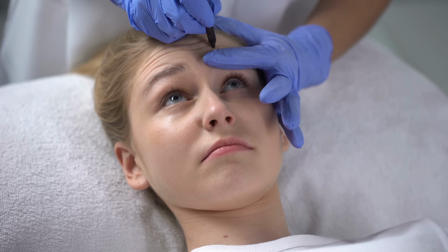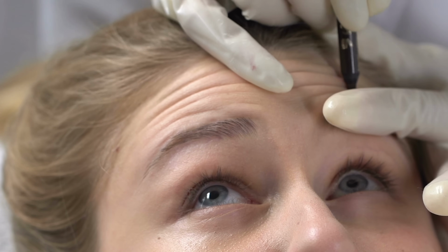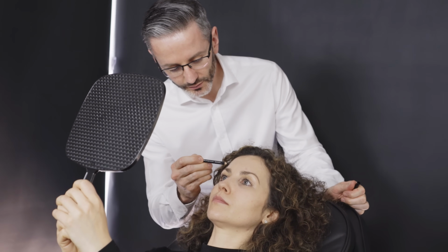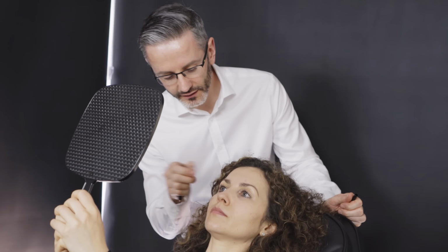Of course, I don't, however, want ladder lines running all the way up into the forehead, which is a side effect of undertreatment of the frontalis. So I need to shape this area of untreated muscle so that it lifts without causing lines. This is why I draw a line up to the hairline, so that I can see the direction of the vector I'm trying to increase.